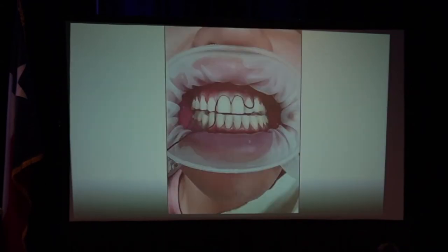So I usually break the contacts. You do a slice prep. Your contacts are all in porcelain. It's a lot easier delivery. This one, you're going to have some adjustments probably, because the lab, the ceramists will tell you they love it when they can control the contacts when it's on enamel. You know, teeth shift, so there's that in your impression process, but it went through a lot easier. I'm just saying that as a dentist, I would want to be conservative, so these are conservative preps.